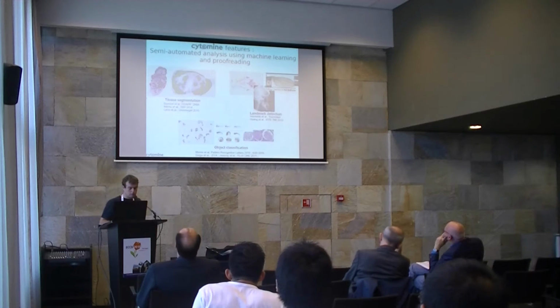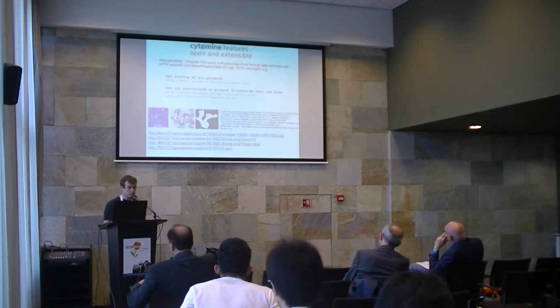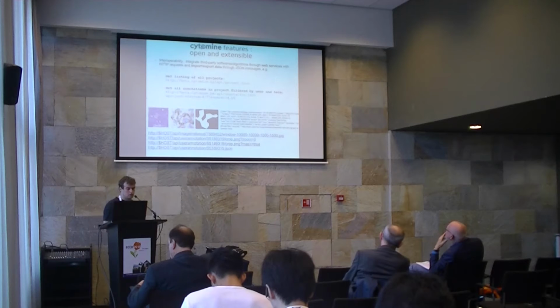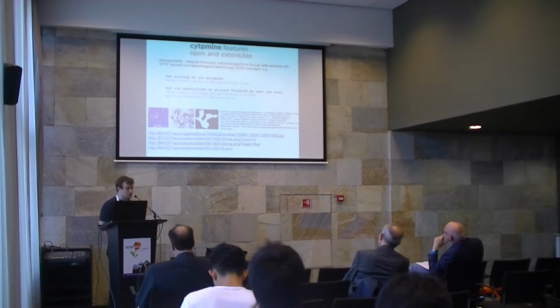But of course, all these algorithms are not solving all the problems in pathology. So we put a lot of effort into making the software open and extensible. As I already said, every piece of data is accessible through HTTP request. It's a more technical slide, but briefly, you can access, for example, the list of all the projects, or you can filter the annotations that have been drawn by a certain user in a given project and a certain type of annotation. So you can really export all the data from this software.